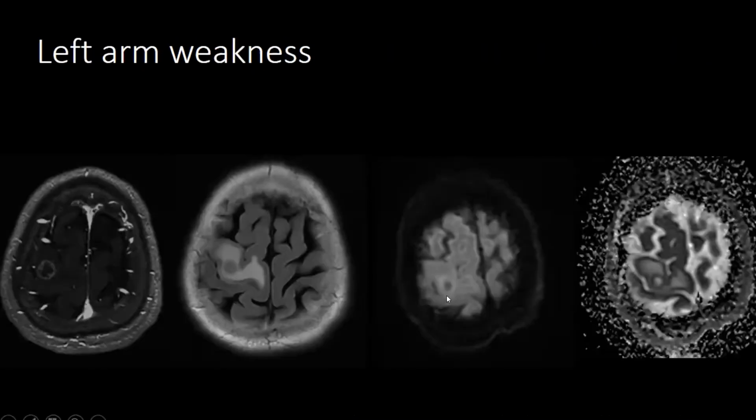On the corresponding diffusion map, you see there is a hyperintense signal in the rim corresponding to the enhancement. Now, you must go back to the ADC and you can see that there is a thin rim of hypointensity, which is basically because of the cellularity of the tumor. But in the center necrotic area, there is no restricted diffusion. As you all know, when you have a ring enhancing lesion in the brain and the patient is presenting with symptoms, you can always have an abscess, which has to be the differential diagnosis.